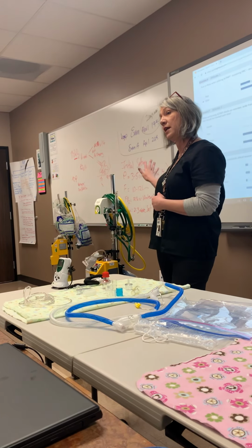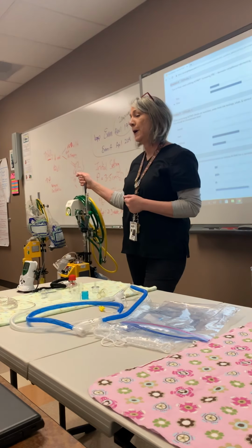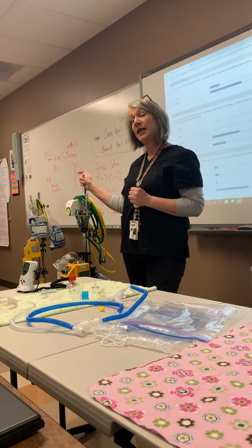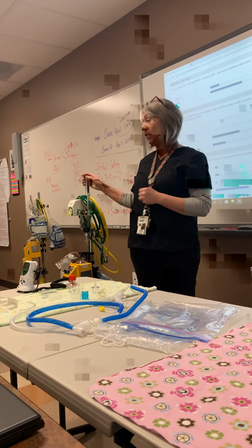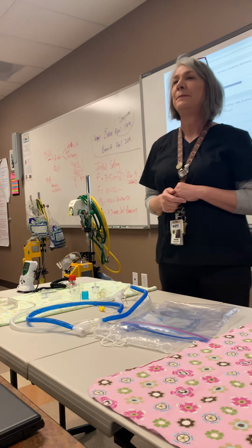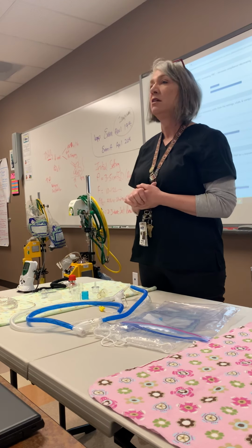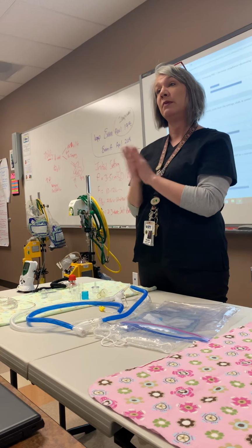Are you clear on the initial setting? Yeah. So here, I'll give you another example. You're going to have a baby who has come from post-resuscitative care, and you're delivering pressures of 30. Where would you like to set their pressure at on CPAP? I guess 5? 5 is fine, but you could go all the way up to 6 or 7. All I want you to see is that that's not baseline. So I might want to give them a little bit more.